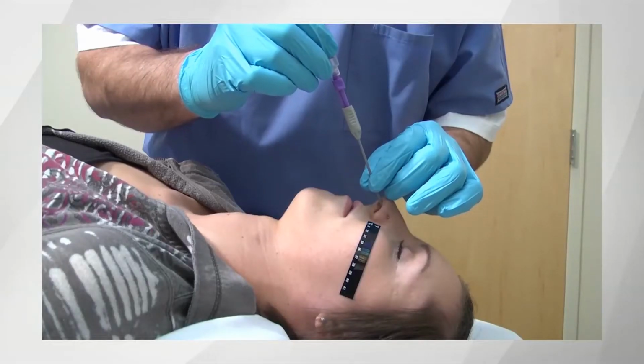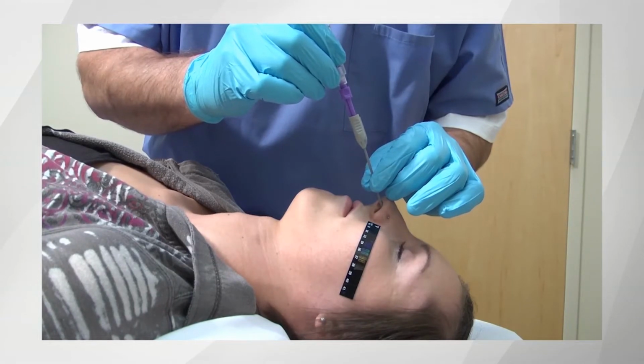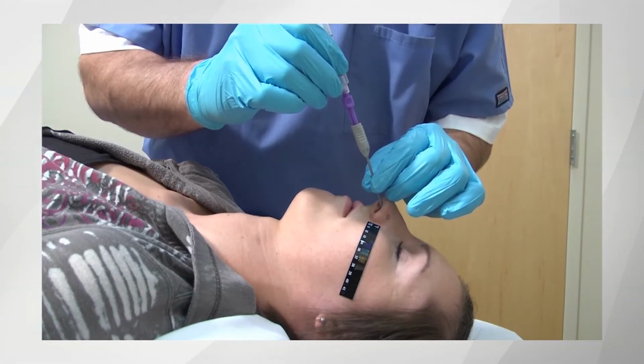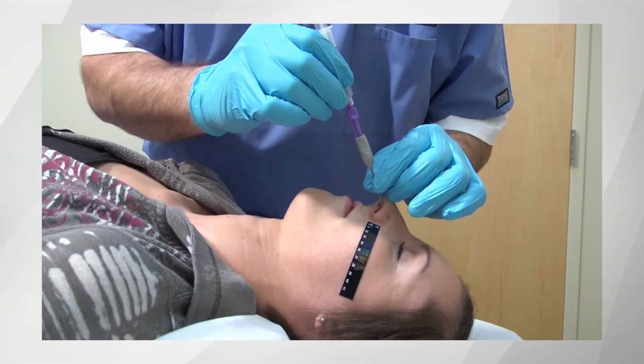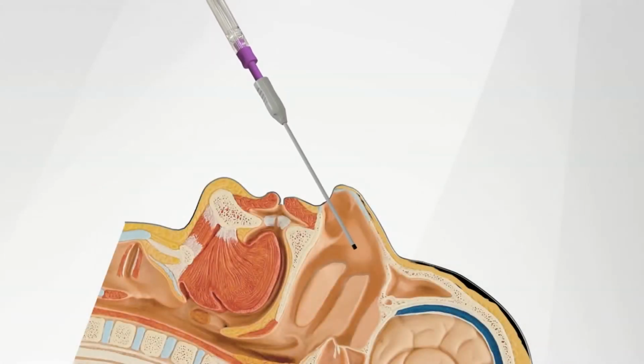Care should be taken to make that contact as gently as possible, as it will likely be the only truly uncomfortable part of the procedure for the patient. When first attempted, this procedure may seem counterintuitive to some practitioners compared to other transnasal insertions, as it does not involve esophageal or tracheal targeting such as NG tube placement or nasal tracheal intubation.